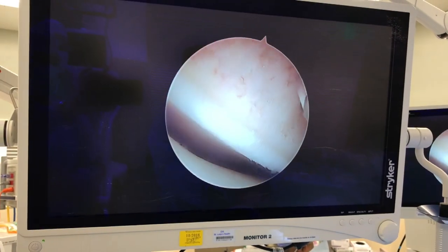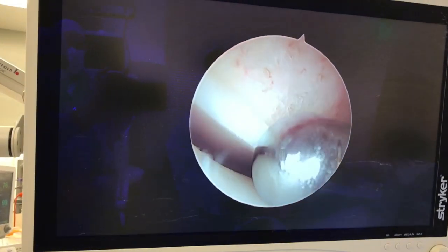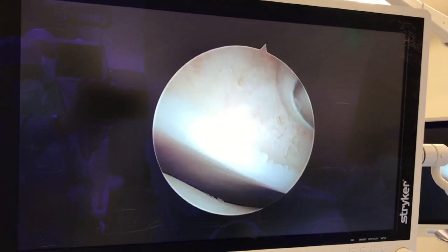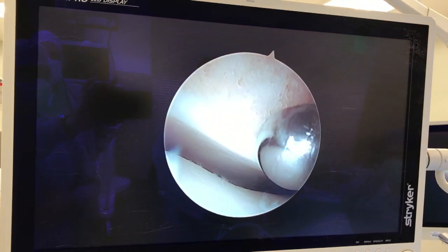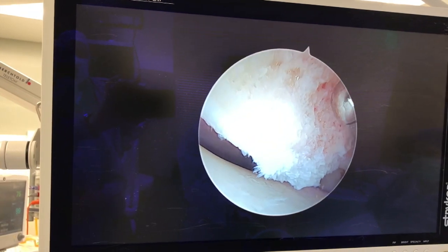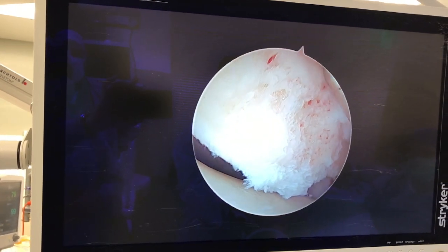Now you can see this area here where we've done some of the correction. This is the subchondral bone that was loose before — we corrected all this up here. You can see where the cartilage is attached to the bone, and over here is a piece where there's really a lot of fracturing going on right up here.